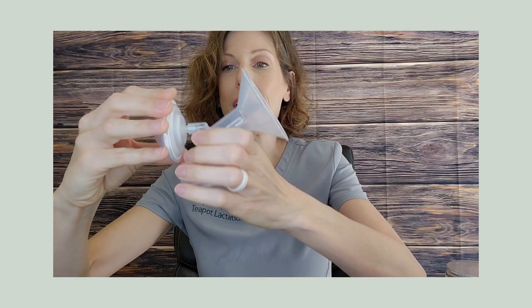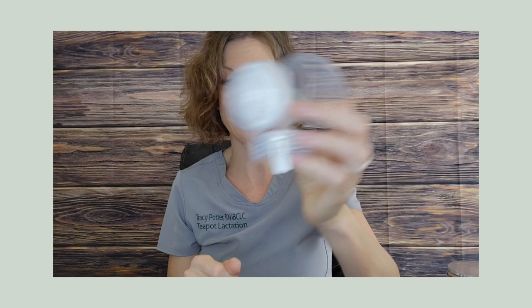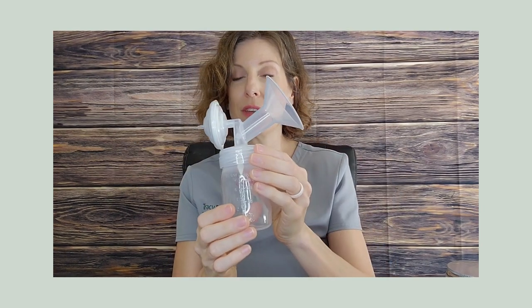Assuming you have all your pieces sterilized and ready to go, we're going to talk about how to put everything together. To assemble the backflow prevention pieces, there's a rubbery valve-style piece that fits carefully around the end piece, and then that pops on to the other side. There's one side where the port is skinnier — that's the side the tubing pushes on to. The duckbill valve piece pushes on to the base of the flange, and the larger side of the backflow preventer pushes into the back of the flange. The bottle screws on to the bottom of that unit, and this makes one pump set. I have a separate video about how to figure out what size flange you need — please watch that before your first use, as it's really important for best results.